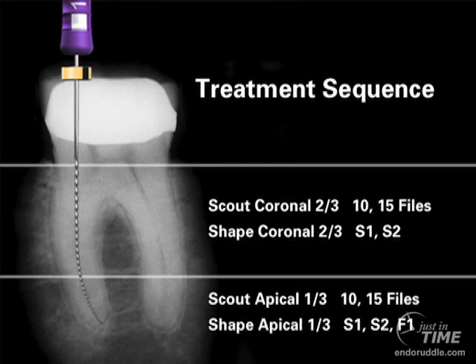So the big three, working length, patency, and glide path, is only determined once we have done coronal pre-enlargement. If we can get a nice, smooth, reproducible glide path in the apical third, then this region can be mechanically shaped with 3 instruments, typically the S1, S2, and F1, and then we'll look at another segment of finishing criteria to know when we actually know we're done shaping any given root canal system. So in a sequential glide path, we're going to focus first in the upper 2/3.